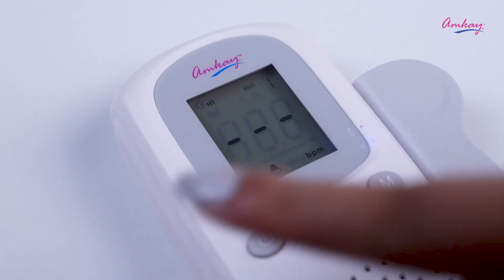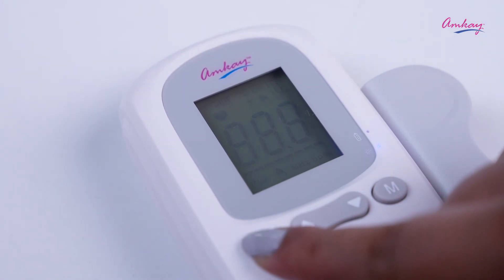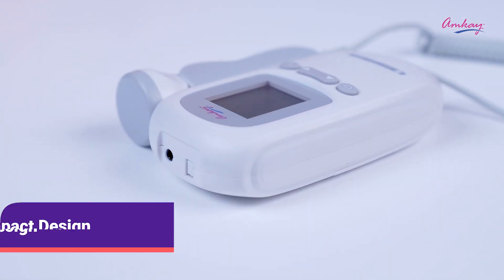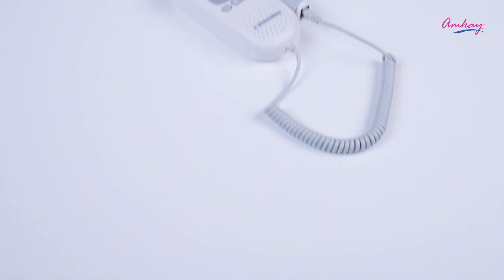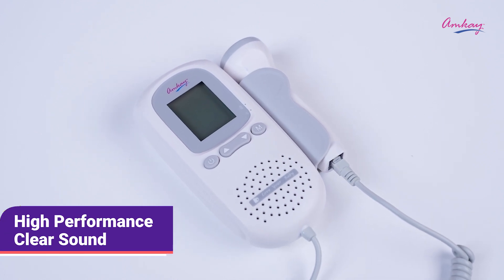After using it, press the power off button three times to turn off the machine. It's a highly sensitive Doppler probe with compact design and easy to operate, and it also has high performance clear sound quality with earphones and speakers.